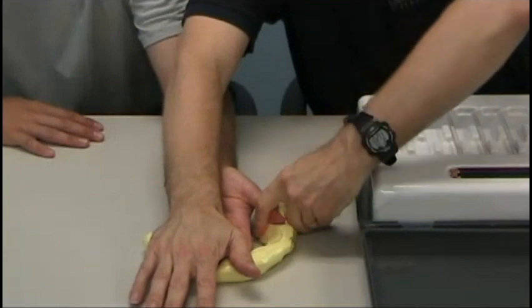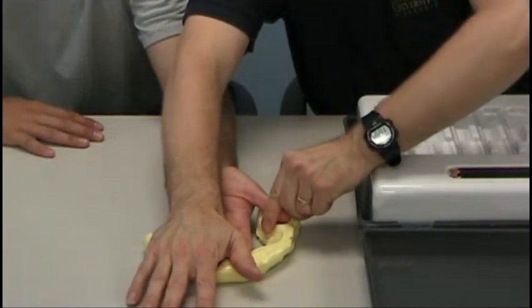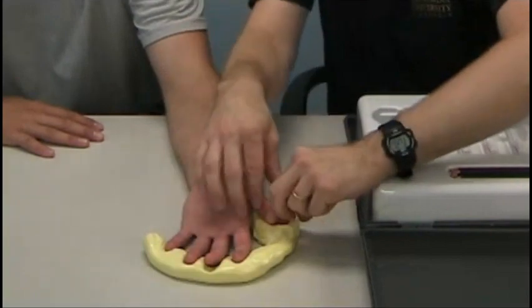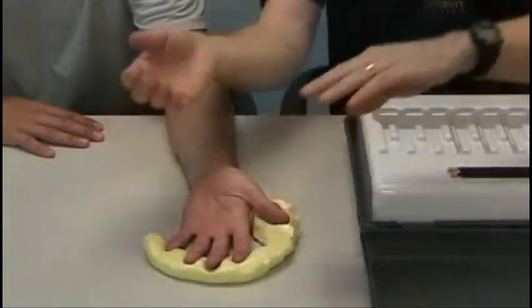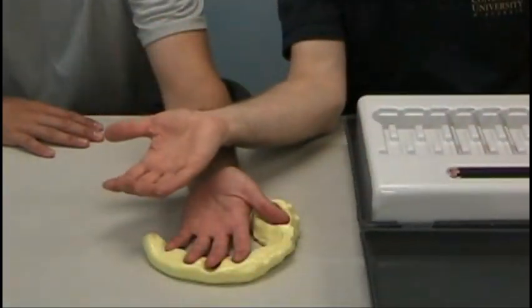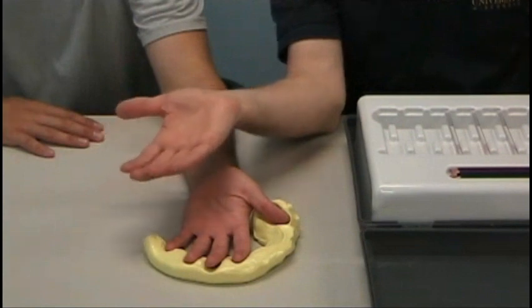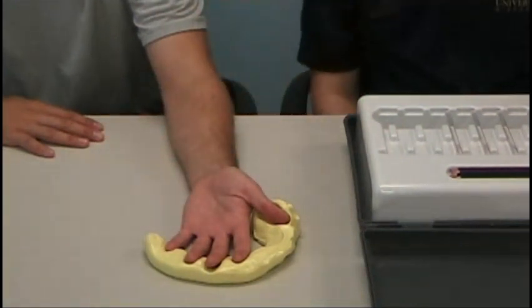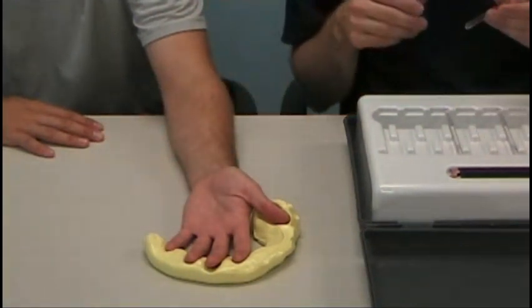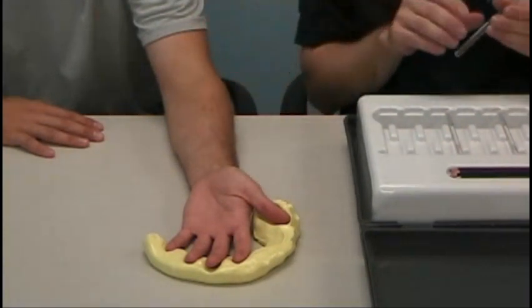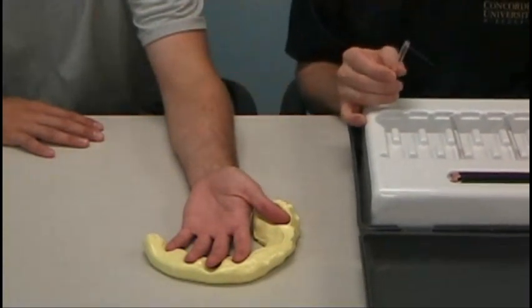That keeps the patient from twitching or pushing up against the monofilaments, which would greatly alter the test because it would increase the velocity with which the filament contacted the skin.